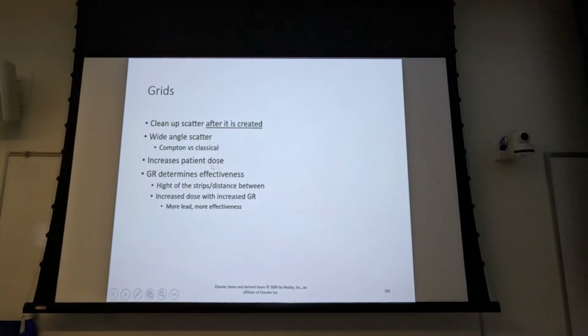So they do increase patient dose significantly. They increase dose by generally 3 to 5, maybe even 6 times. So we only want to use a grid whenever we have to, right? Grid ratio determines the effectiveness. That's the main thing that determines the effectiveness.